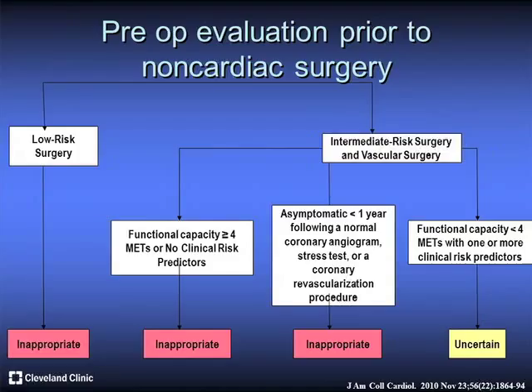Now, prior to non-coronary cardiac surgery, so valve surgery, myectomy, other cardiovascular surgeries, if your pretest likelihood is low or intermediate, then it is a good option to consider CT angio. If it is high pretest likelihood, then just send them straight to the cath lab. AFib, basically, I would not recommend CT angio. At least the guidelines don't recommend CT angio.